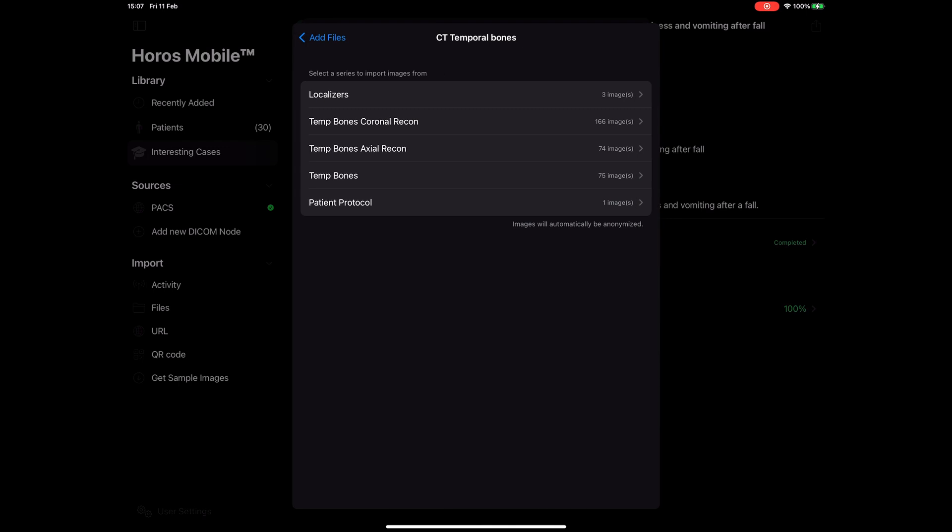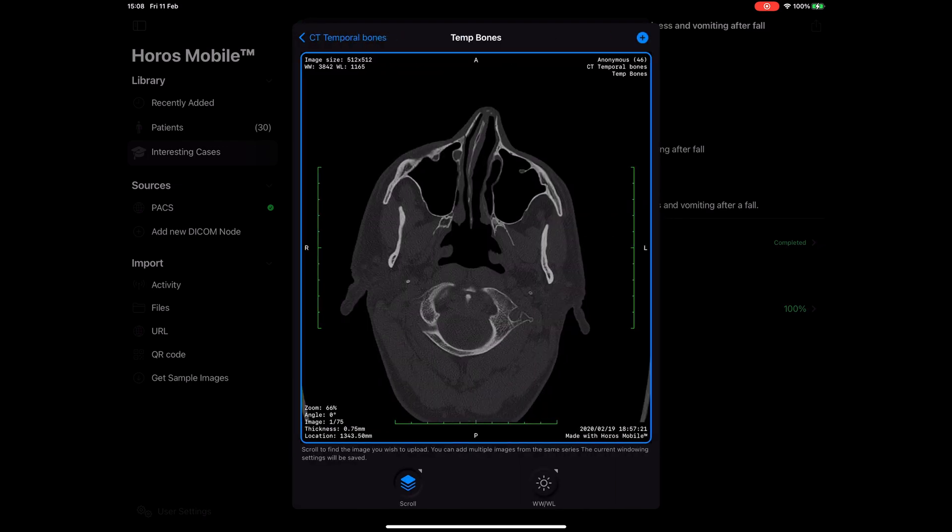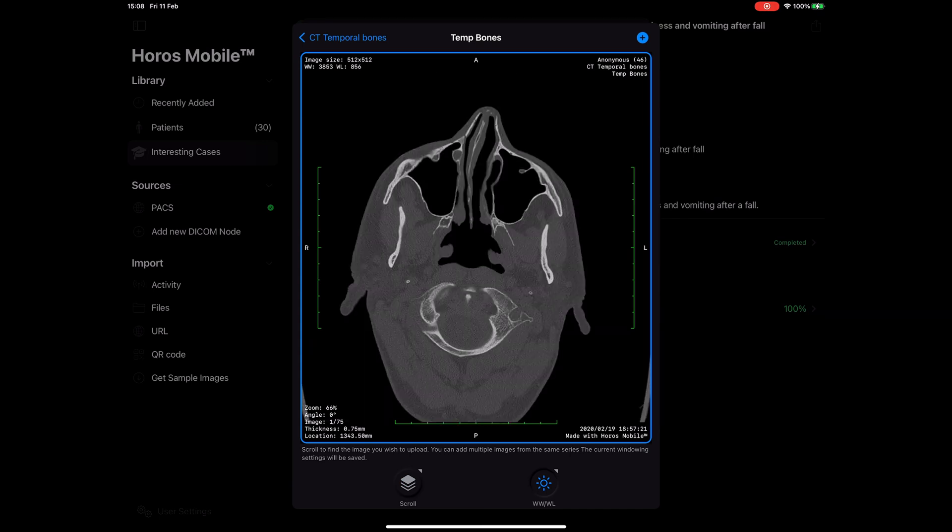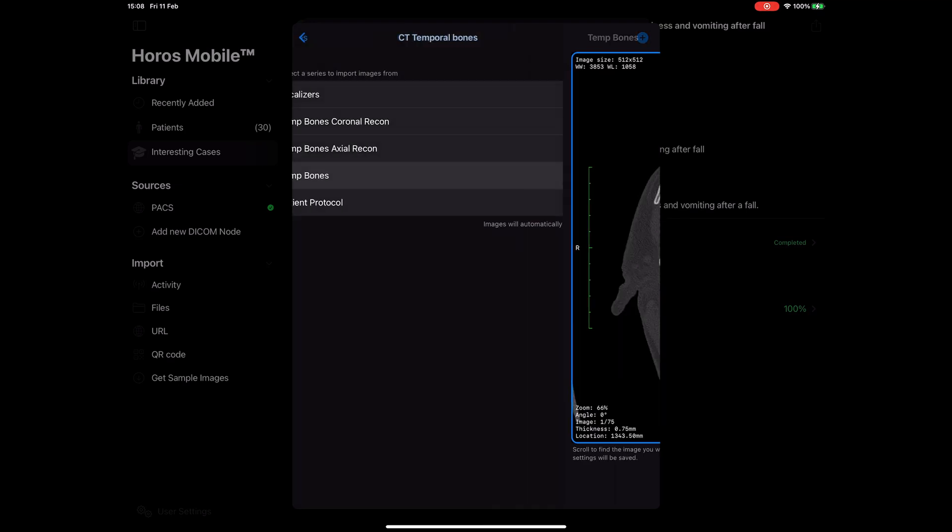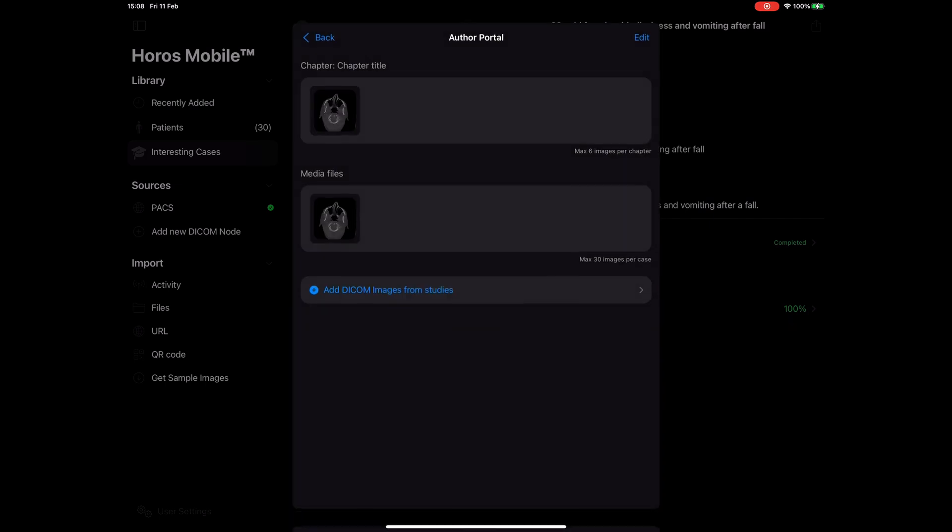You can drill down to any series and then select the image that you're looking for. Change the window width and level to adjust the way your image looks. Tap the plus button on the top to add this image to your chapter.